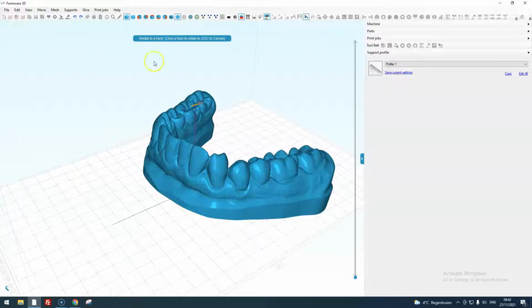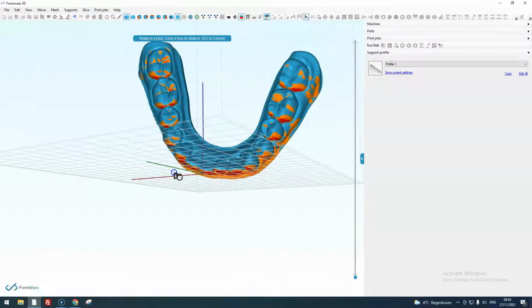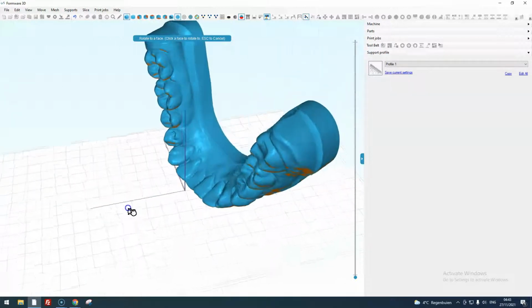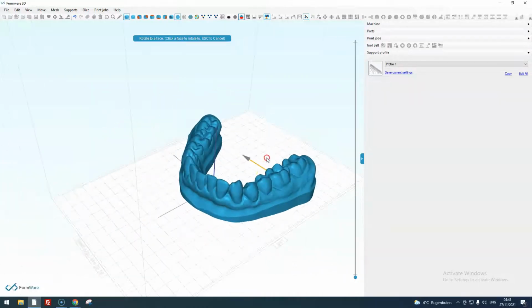And when you click this, you will go into the rotate to face mode, and hovering with your mouse over the part will show you an arrow that will be aligned to the face normal. When you click, the part will orient itself, and the face that you clicked on will face downward in the negative Z direction. I can also turn it back like this.